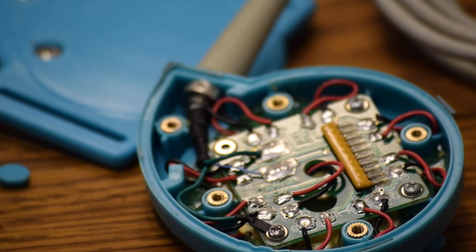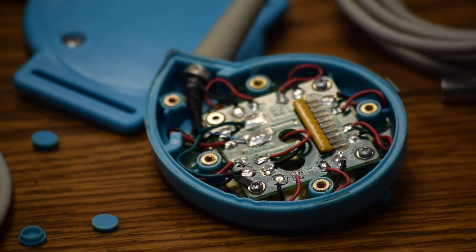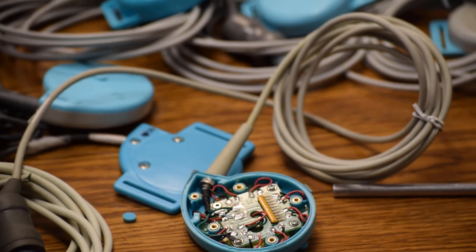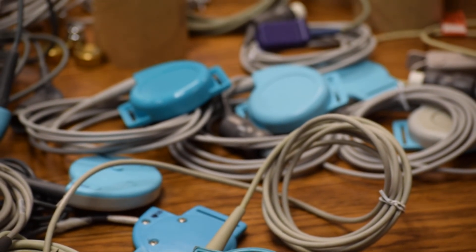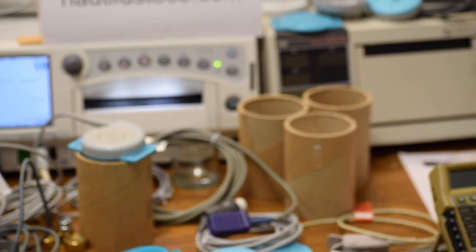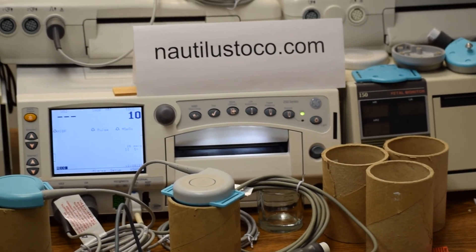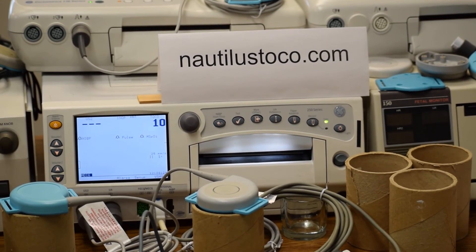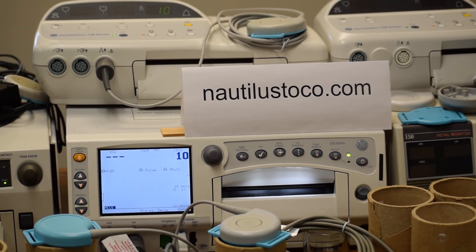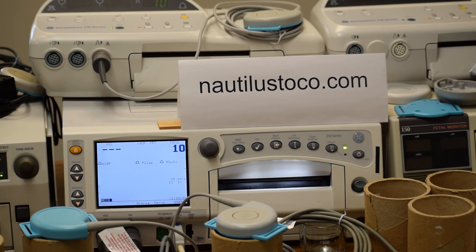At Avron Bionics, we repair OEM transducers using OEM quality parts and compliant processes. We offer a lifetime warranty on crystal bonding. The ultrasound beam quality will be exactly as if it were a brand new transducer from the factory, performing to exact factory specifications. The default warranty is two years, but with lifetime warranty on the crystal bonding, you will never have a rattling problem or performance issues over time. Please visit nautilustoco.com or give us a call — we look forward to an opportunity to serve you with OEM quality.